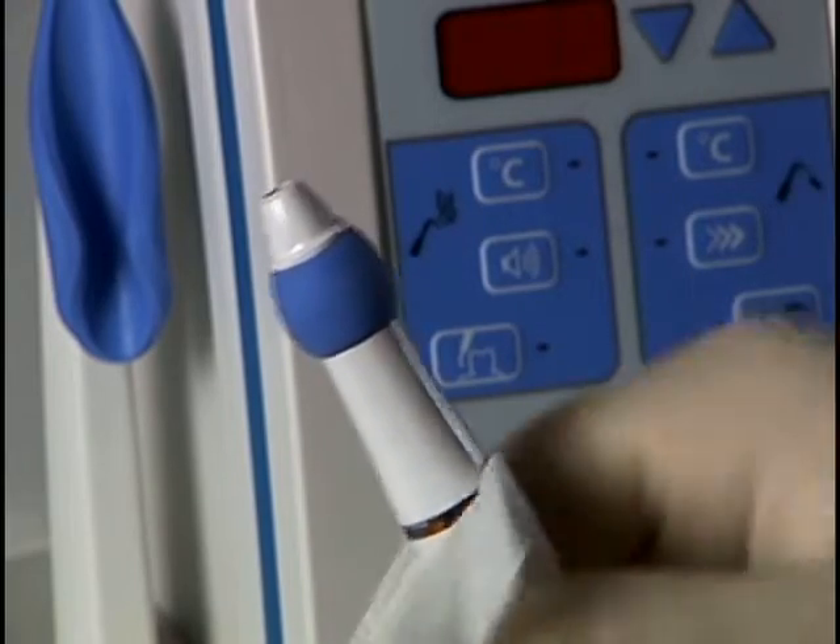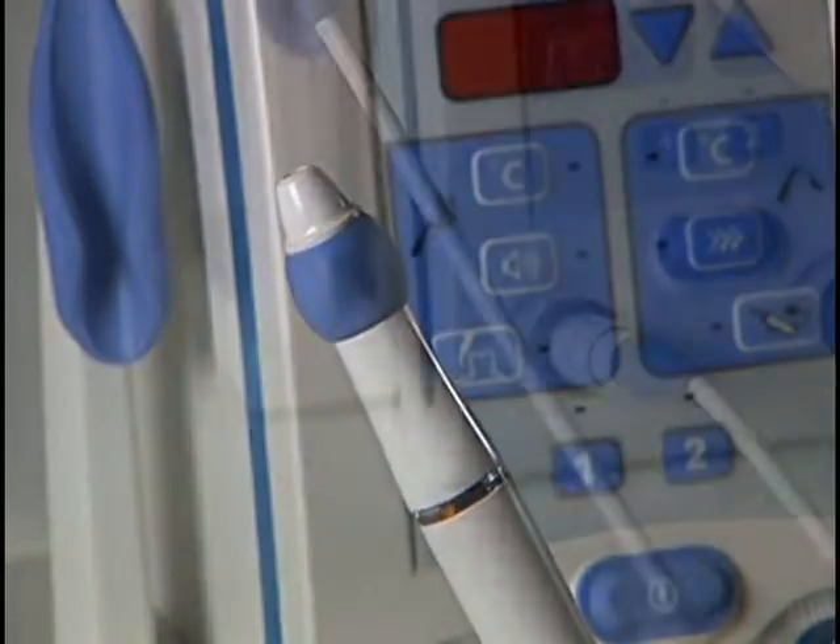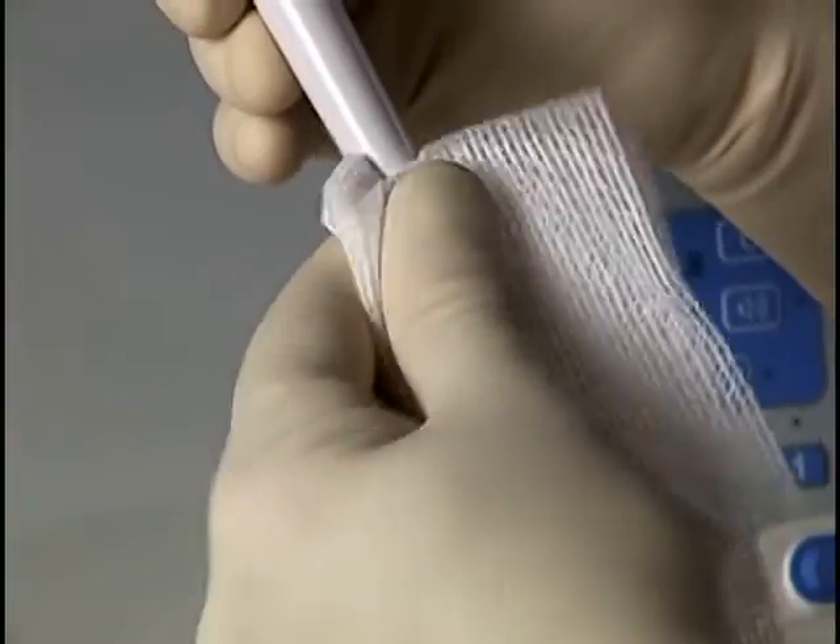The pack handpiece is cleaned in a similar manner. Wipe with a non-chlorinated disinfection solution from the middle of the cord to the end of the handpiece.